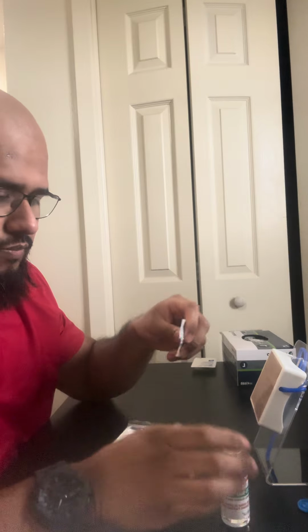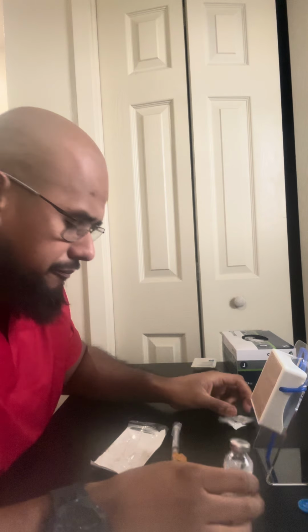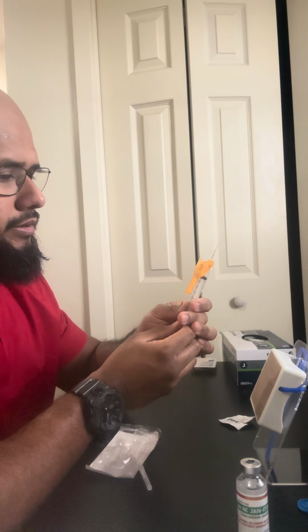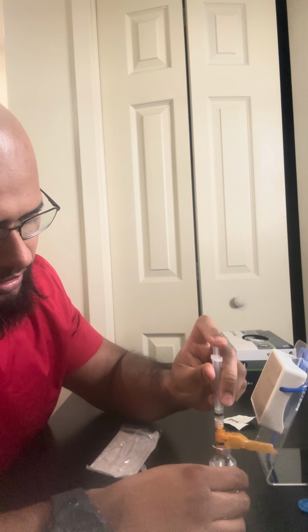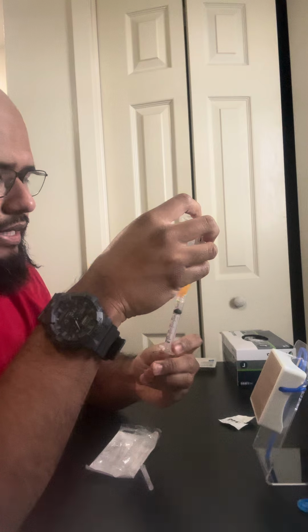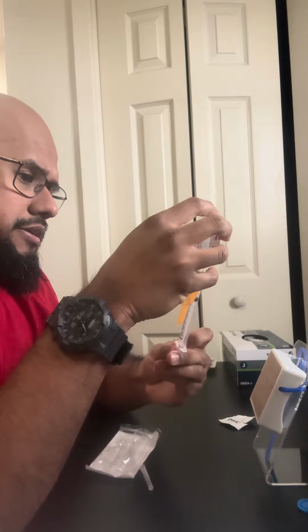All right, since the vial is already open, I'm going to clean it with an alcohol pad and let that air dry. Okay, this is my blunt needle, like I said. Let's do half a milliliter. That's what the order was, half a milliliter. Straight down, inject the air. Turn it upside down. Now you just get the half a milliliter, or whatever the order is.